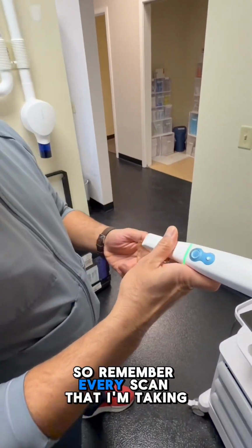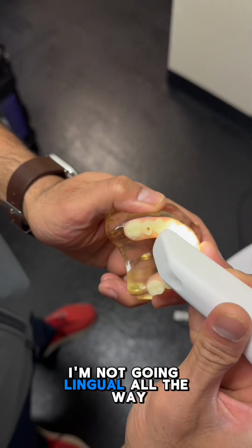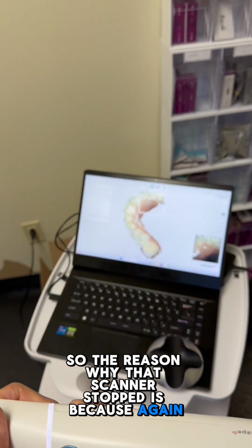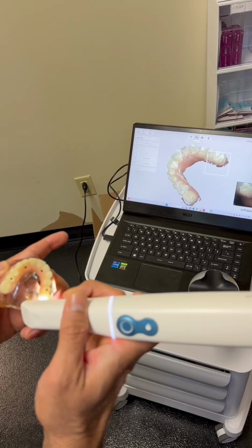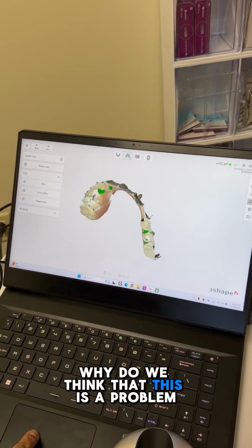So remember, every scan that I'm taking, I am making sure that I'm not going palatal, I'm not going lingual all the way. Let's think about it this way. The reason that scanner stopped is because, again, I did not give enough time to stitch the images together. Now let's say I just did a palatal scan right now. Look at this scan again. Why do we think that this is a problem?